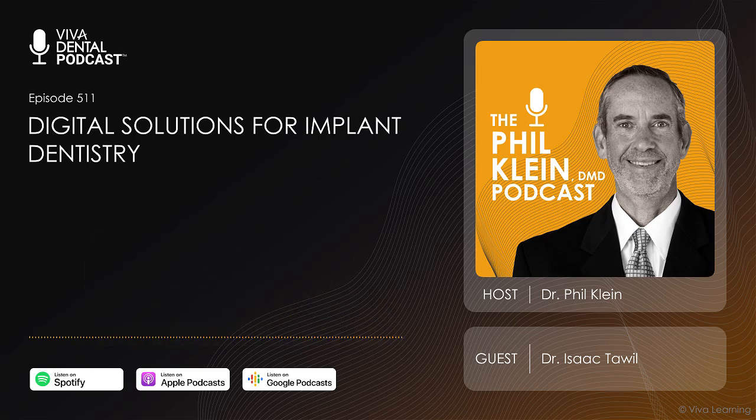As far as for implants, it has been truly, truly revolutionary, because one of the things that patients can't stand is having the gook in their mouth from impression material, and also having the ability to capture that. Part of the problem was that we used to do closed impression trays. We'd place an impression transfer into the mouth, and we'd flow some material around it. While you were painting the tray, while you were getting everything ready, the tissue is always trying to creep back over. So you've lost a lot of that sulcus that we were trying to capture around the implant. So it really did hinder us. We've come up with lots of different fancy ways, like open tray impressions, adding composites around impression transfers to try to hold back that tissue.